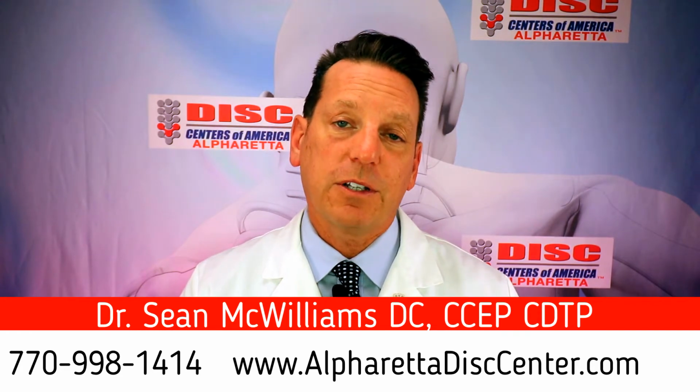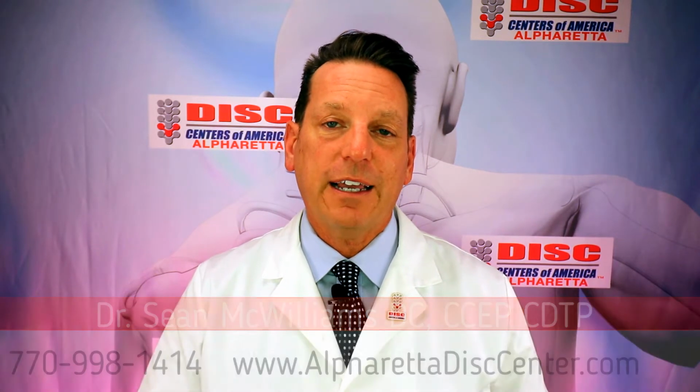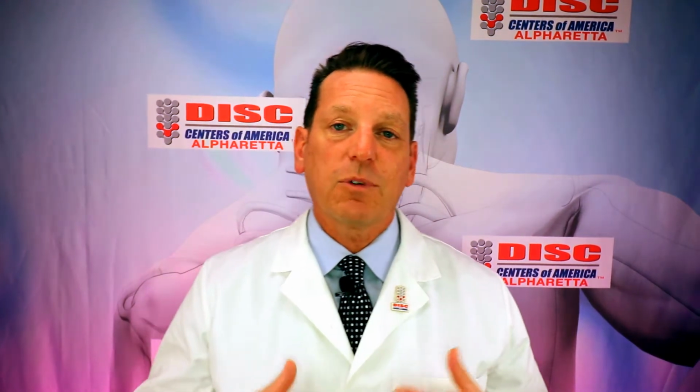Today what I want to talk to you about is how to understand and read your MRI report. I know that it can be a very stressful time anytime that someone sends you for an MRI, because normally when you're getting imaging of that type of quality and magnitude, some doctor in your life is trying to look for something very specific. So what I'd like to do is explain to you a little bit, especially because we specialize in spine and disc type diseases.